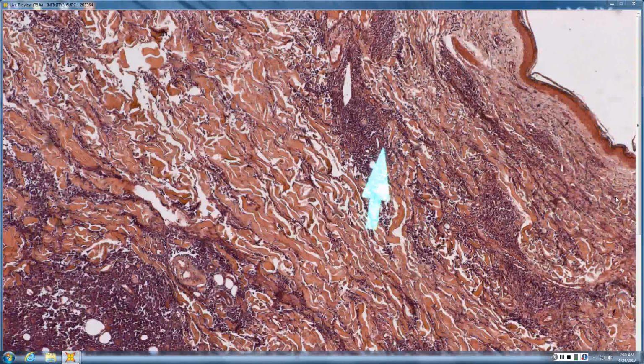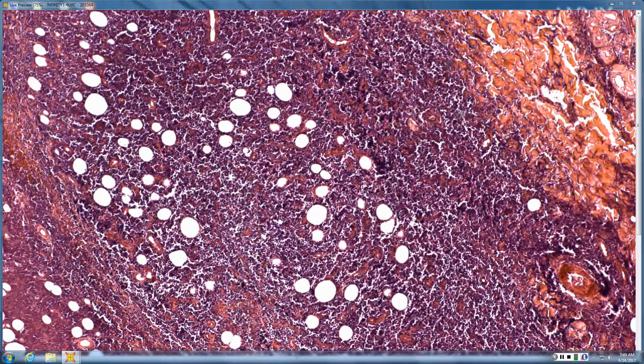Your blood vessels pretty much have normal lumen. In a reactive infiltrate, the blood vessels and the epithelium tend to be reactive. So you have PEH, hyperplasia of the follicular epithelium, you have endothelial swelling, proliferation of blood vessels.